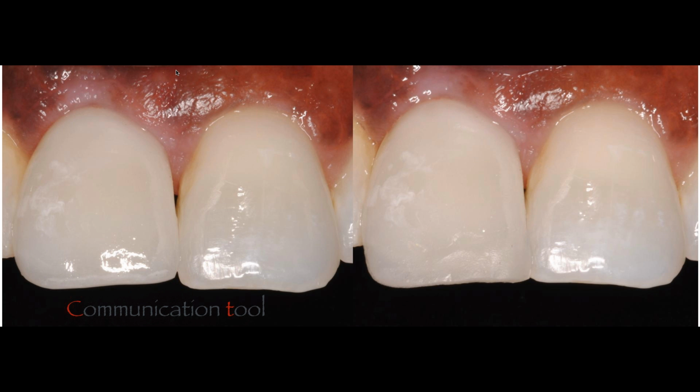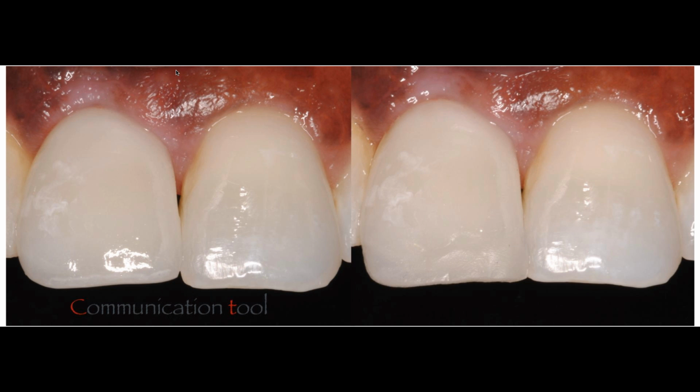We did an impression, and we sent it out to the lab. The lab sent us back the crown, and even though in the cast the crown seemed to be very nice and uniform, both incisal edges were at the same level, tooth number 8 and 9. Once we fit in the crown, we seated the crown to try it in the patient's mouth. Now you can tell on the photo on the left that number 8 is actually shorter than number 9. But that is not the way that it was in the stone.